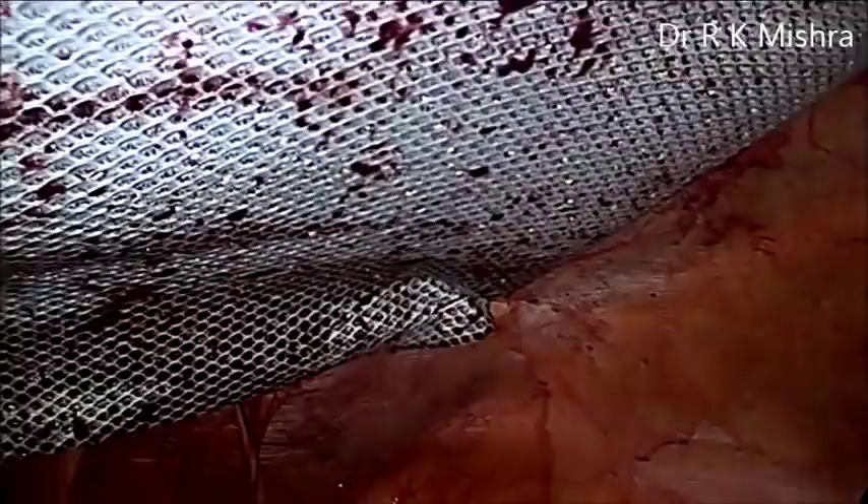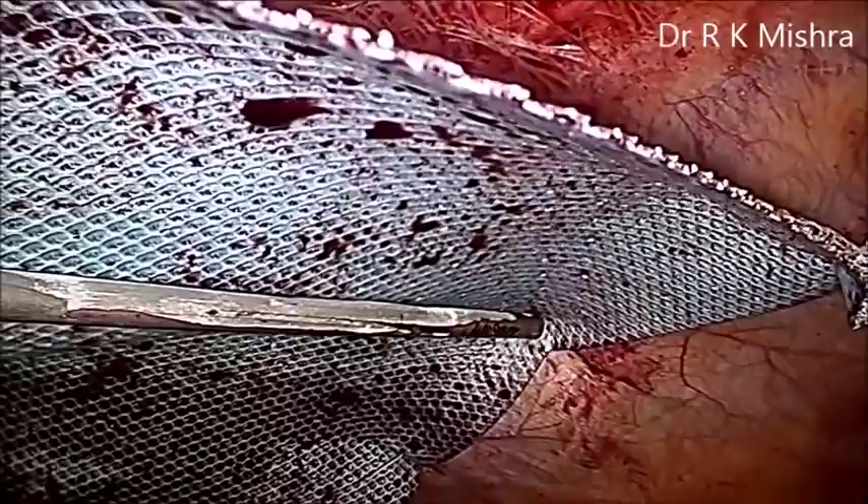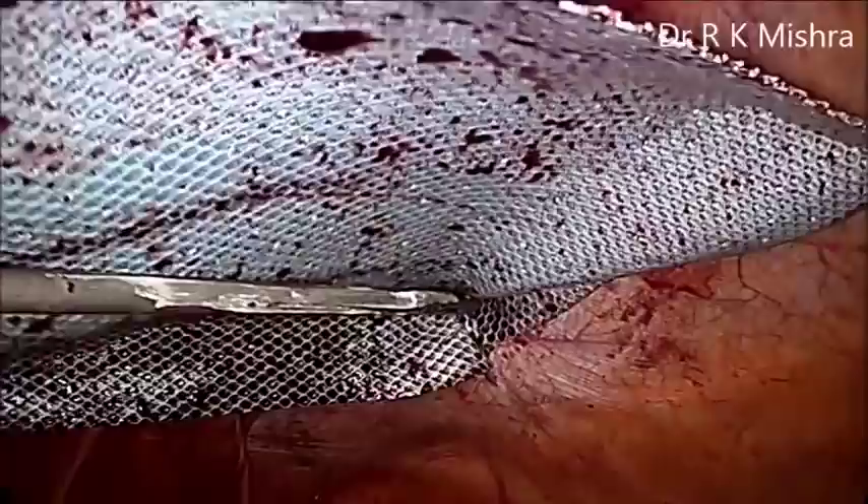Now all four corners are nicely stretched and there is no corrugation left. The suture comes from the same skin prick but pricks the rectus at a different level, so once you tie the knot, the knot goes just subcutaneously. Now we are using the ProTack to do the outer and inner crowning. ProTack is an implant made up of titanium and it can fix the mesh all around. One circle should be the outer crowning and another should be the inner crowning.